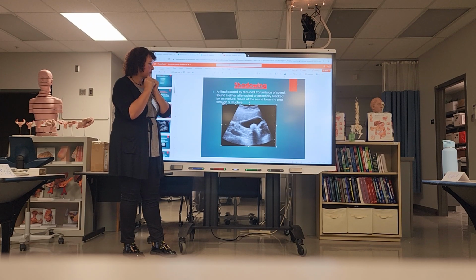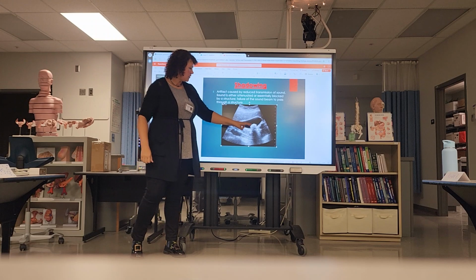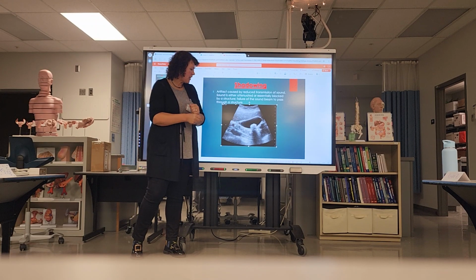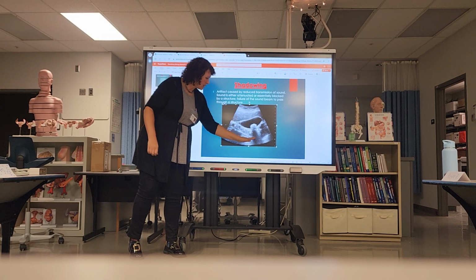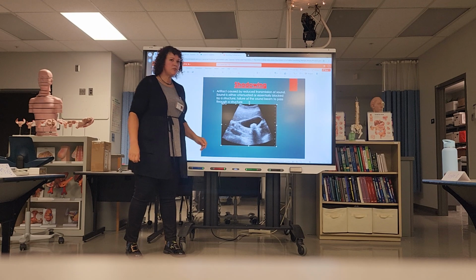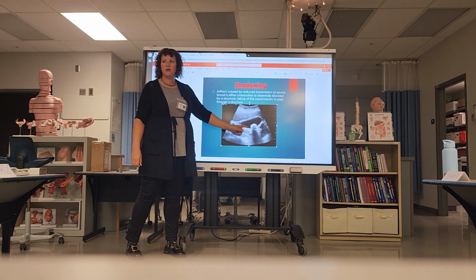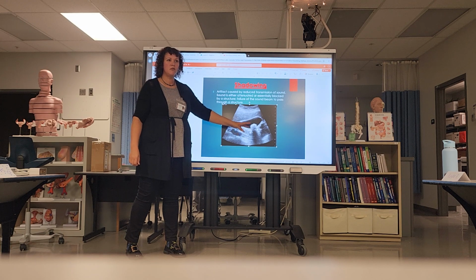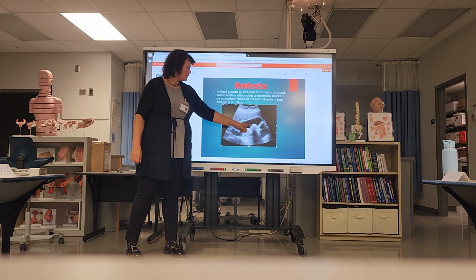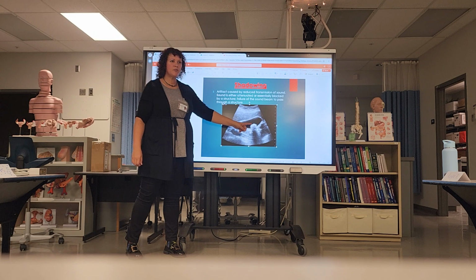And a lot of times you will have echogenic structures that are super duper dense, that sound beam cannot penetrate, and will create this shadowing. Sometimes it's calcified. So this is not a calcification, this is a gallstone. It's made out of bile. But this is as bright as bone. Okay, so this gallstone is as bright as bone.